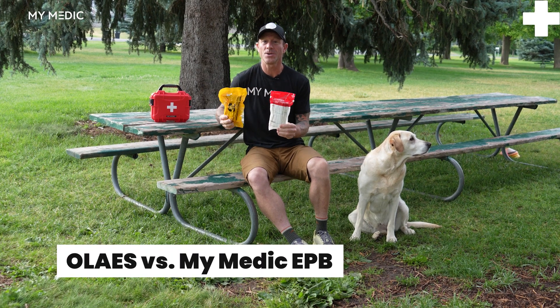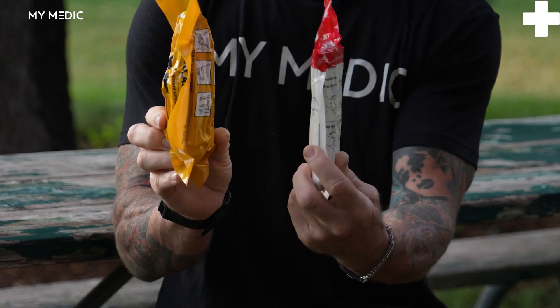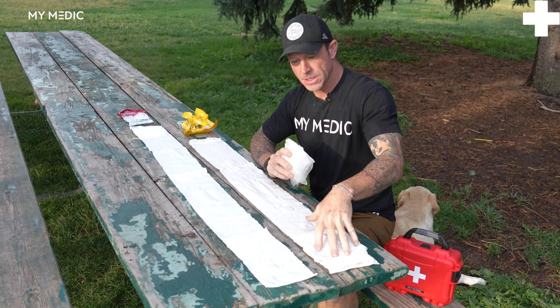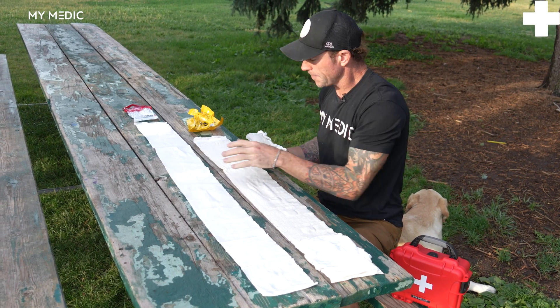Let's do a quick comparison between two EPBs, or emergency pressure bandages. I've got the Mimetic here and the Olias. Here we've got the Olias, and this one is the Mimetic. An obvious difference — you do get a little more length with the Mimetic EPB.